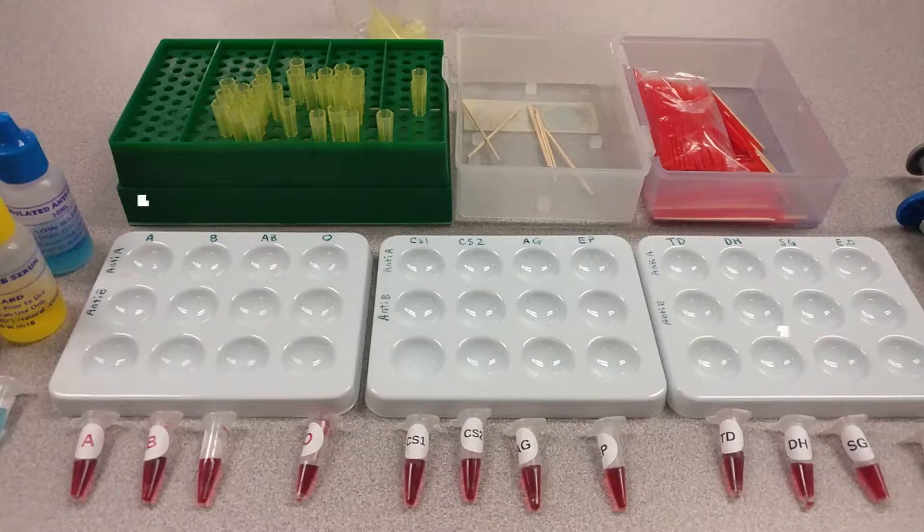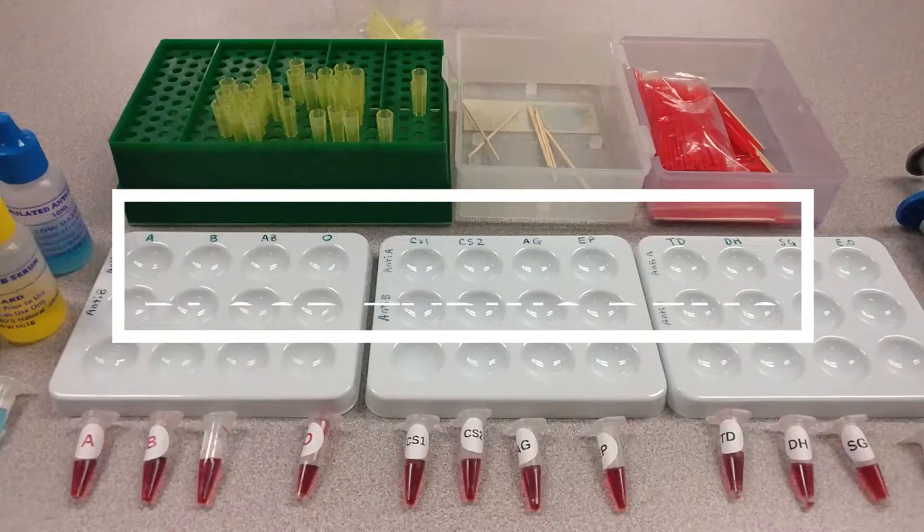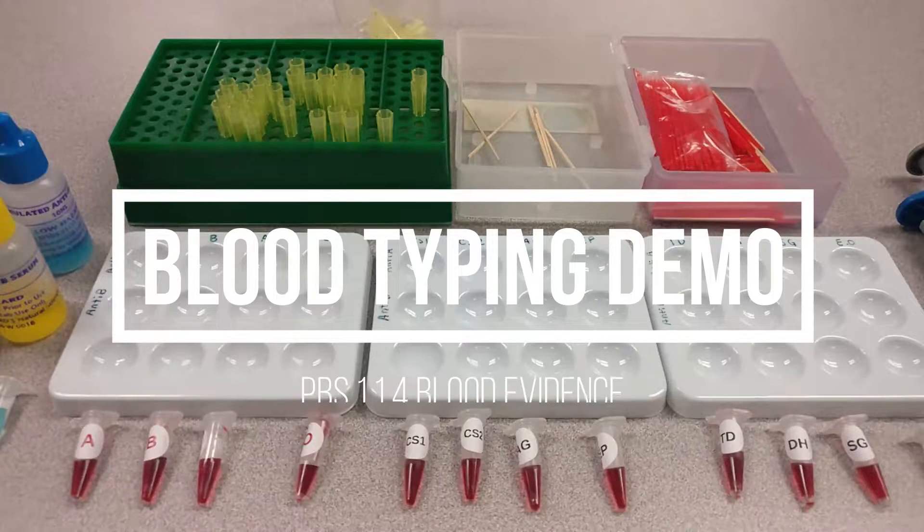Hey everyone, this is the second part of activity 1.14 blood evidence. This part is on blood typing and this is part of the principles of biomedical sciences curriculum at Project Lead the Way.